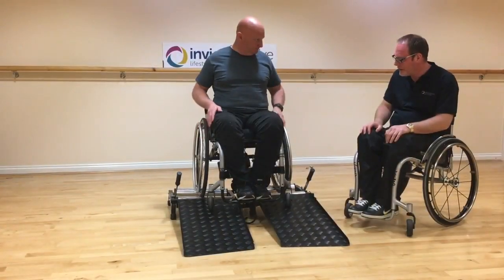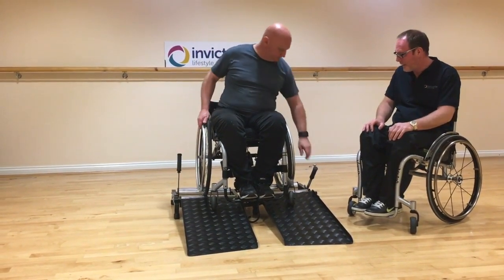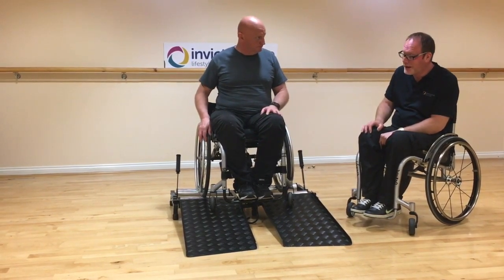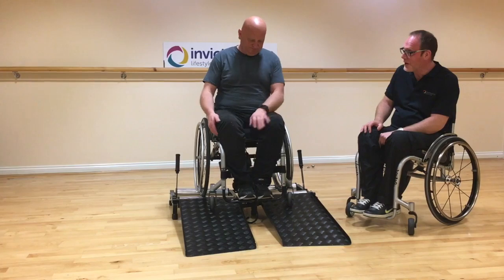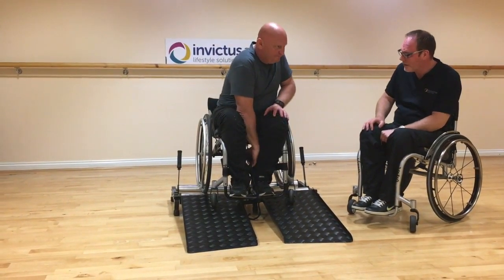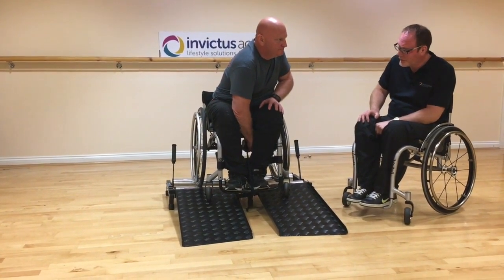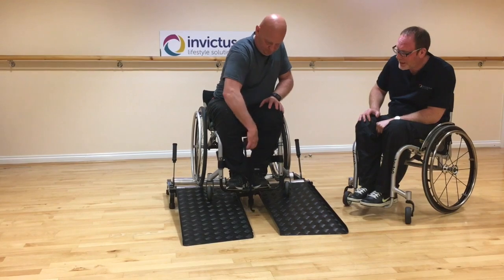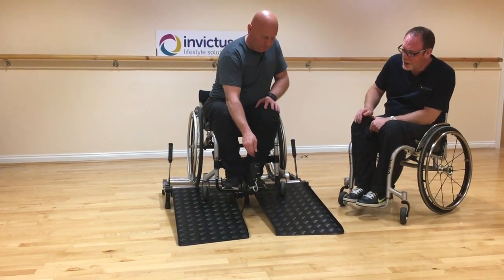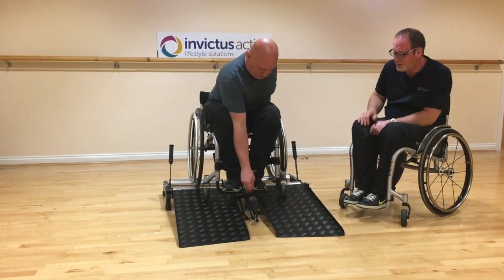To get off, first put both brakes back on in the full upright position. Then, before you try to wheel off, remove your ratchet strap. To do that, reach under your seat — on the back of the ratchet strap there's a little pin. Push that pin down and it'll slacken off the rope, allowing you to remove the ratchet strap. When you wheel off, make sure the strap isn't in the way of the ramps — put it on the floor out of the way.